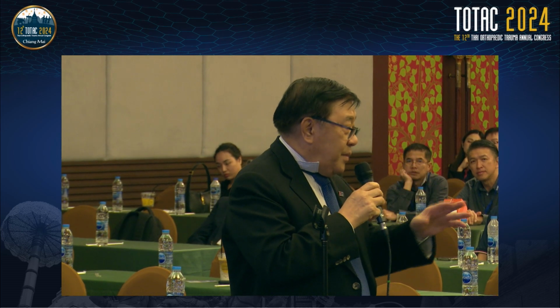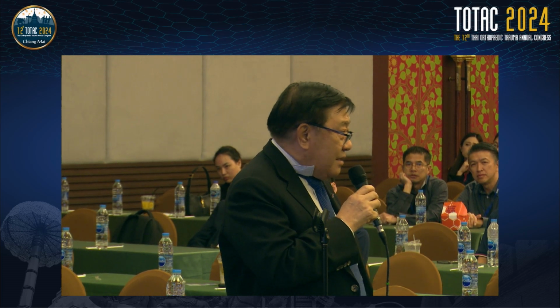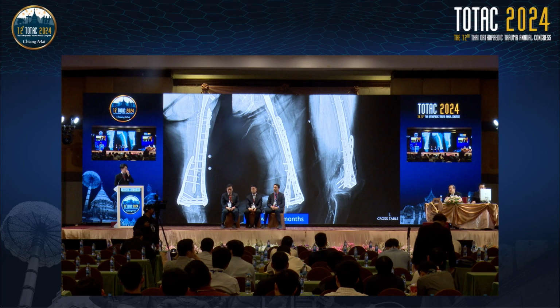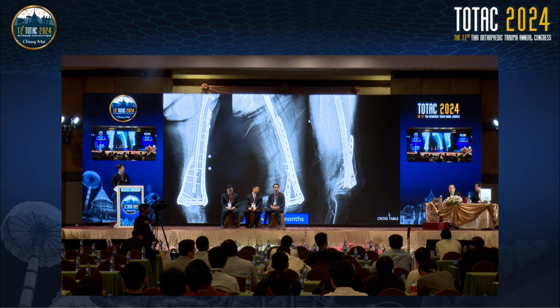That allows the patient, most of the time, to start weight bearing, because they are very old. Even if you fix the lateral side and are satisfied, there are many cases where, because of osteoporosis, the plates start to move, and you don't want to reoperate. So nowadays there is an increasing tendency to put the plate on the medial side. Thank you, Dr. Suthorn, for the comments.